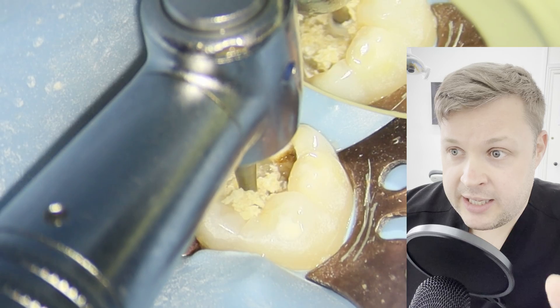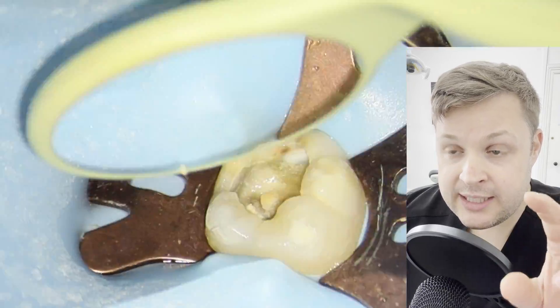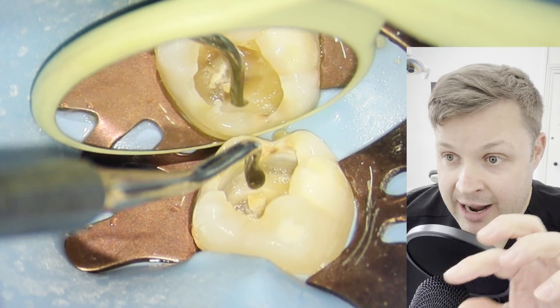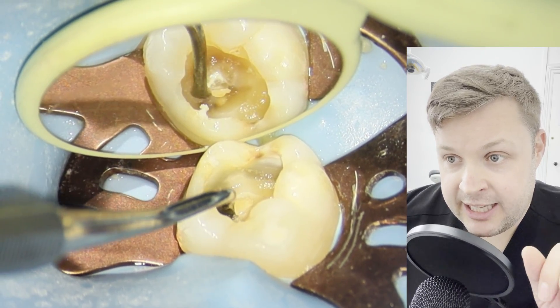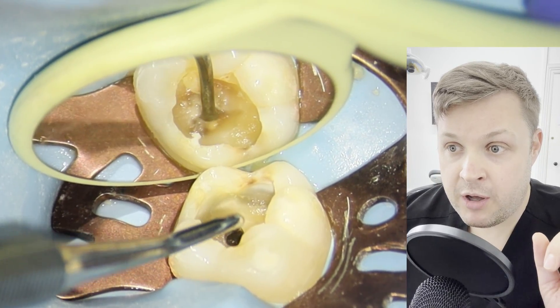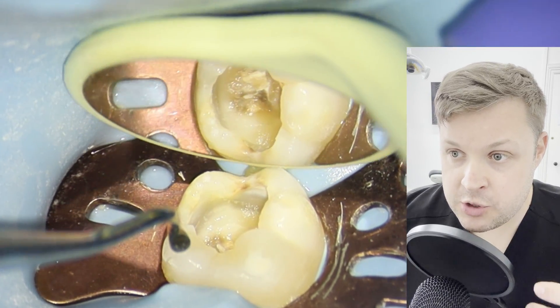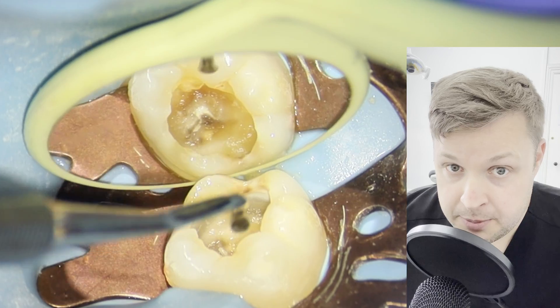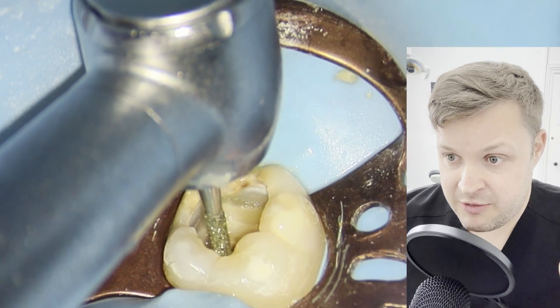I've removed all the filling material without using the fast handpiece on the dentine at all. Now I'm just using the slow handpiece to remove around the base of the cavity. I'm feeling here with an excavator, thinking: is this just a sliver of dentine, or is this the roof of the pulp chamber? I know now it isn't the roof of the pulp chamber, but I'm being very careful — this cavity is very, very deep.